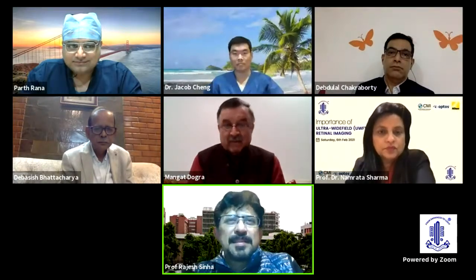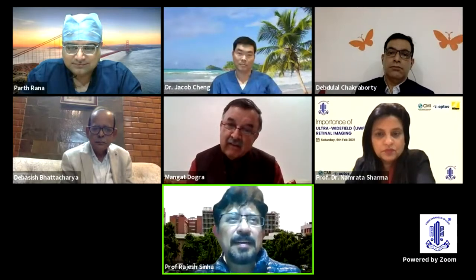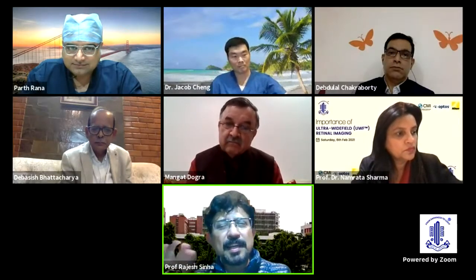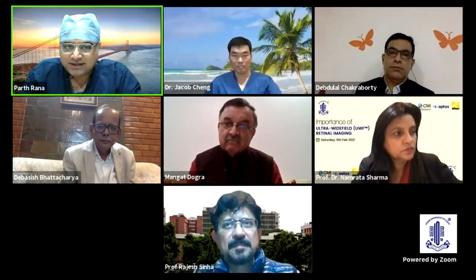Yes. I just have one query for all the retina people: when we do indirect in a case of cataract, doing visibility with the indirect and visibility with Optos, is there any difference? Yes. Definitely. Optos is having better resolution because Optos is using lasers and what we are using is a simple light that gets scattered and we are getting less resolution. But Optos is having better resolution in vitreous hemorrhage or the cataracts and all, even corneal opacities.